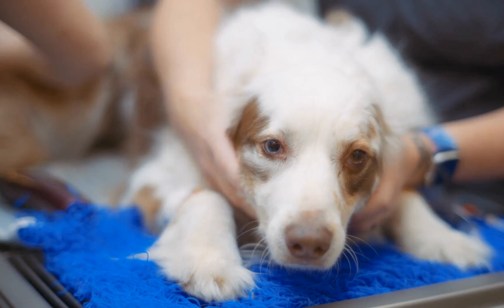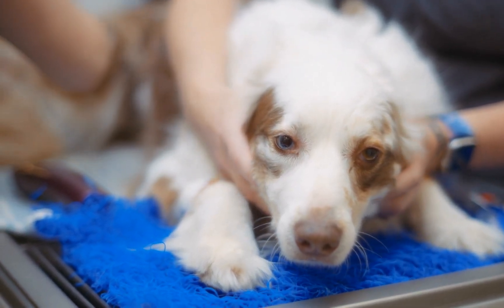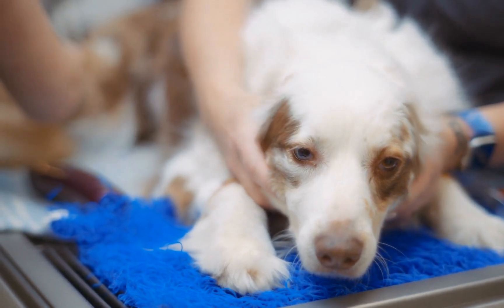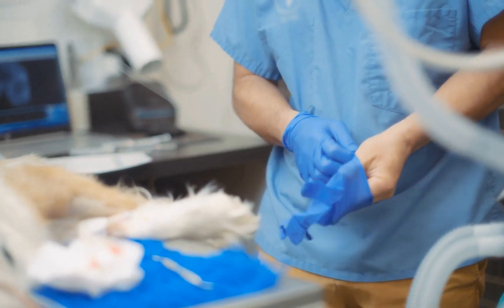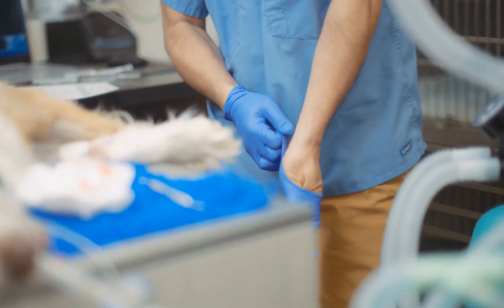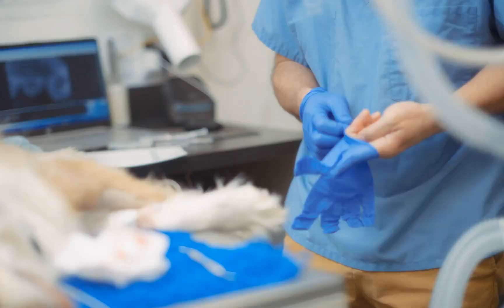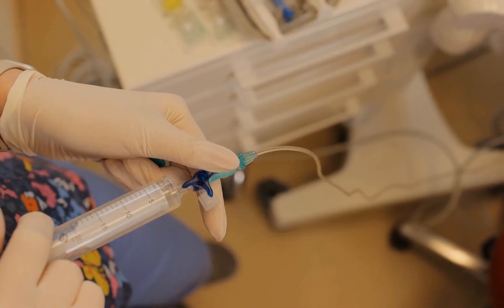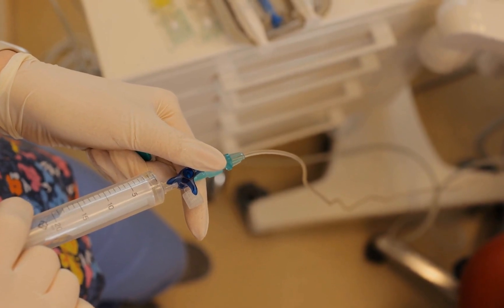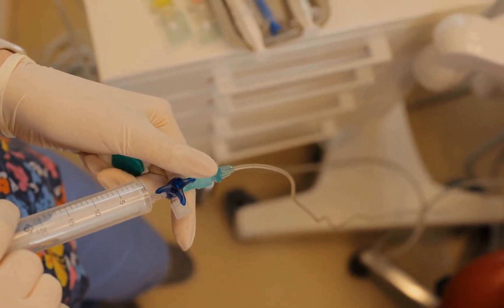For example, imagine you are presented with a patient in shock who has a mild to moderate amount of pericardial effusion. Since you cannot identify any other causes of shock, you decide to perform pericardiocentesis despite its only mild to moderate amount. If this patient's shock resolves after you drain the pericardium, this will allow you to make a diagnosis of cardiac tamponade.